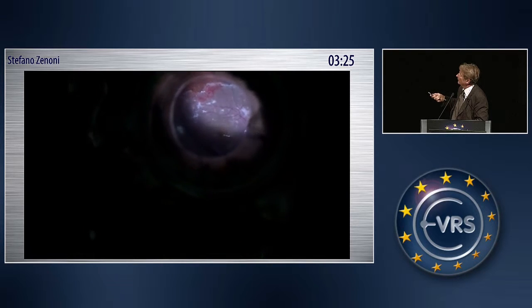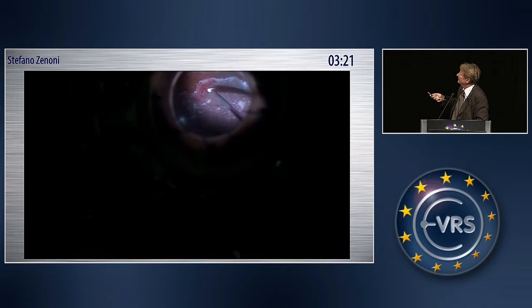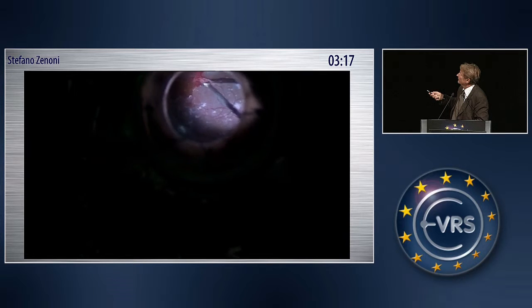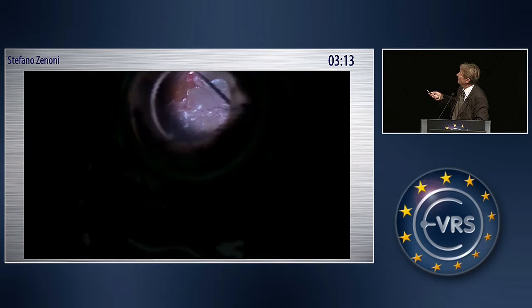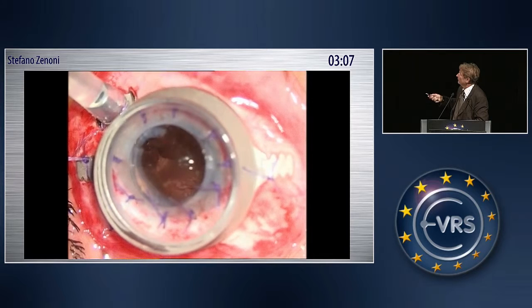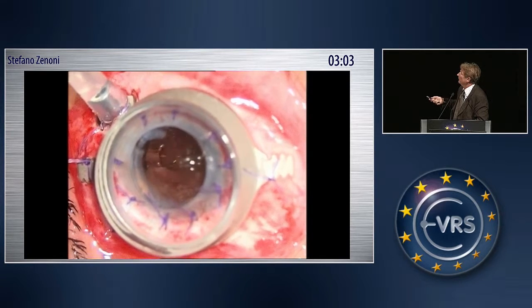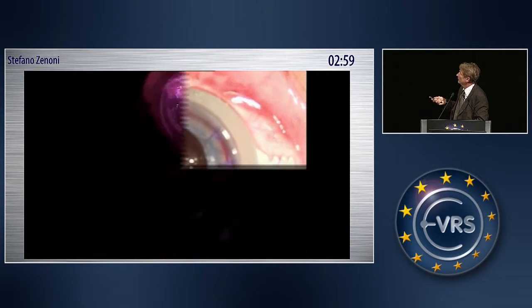After perfluorocarbon, we will perform 360-degree laser. This spatula is important for me because you can destroy all the strands that you can have on the retinotomy that you perform. Sometimes there are some fibrosis reactions. Then we make a perfluorocarbon silicone oil exchange.